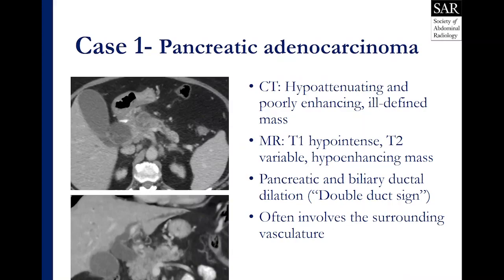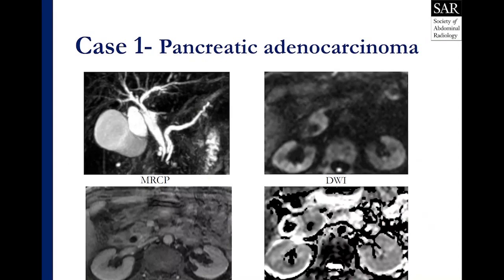Some lesions, namely those in the pancreatic head and uncinate process, will have pancreatic and biliary ductal dilation — the classic double duct sign. This lesion often involves the surrounding vasculature, and so evaluating these lesions can be very tricky because you have to evaluate the vessels one by one to make sure you're describing them adequately for our clinicians and surgeons.